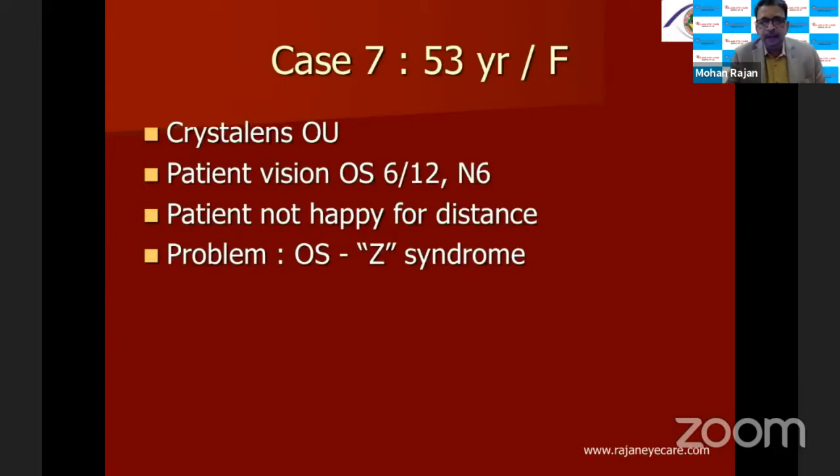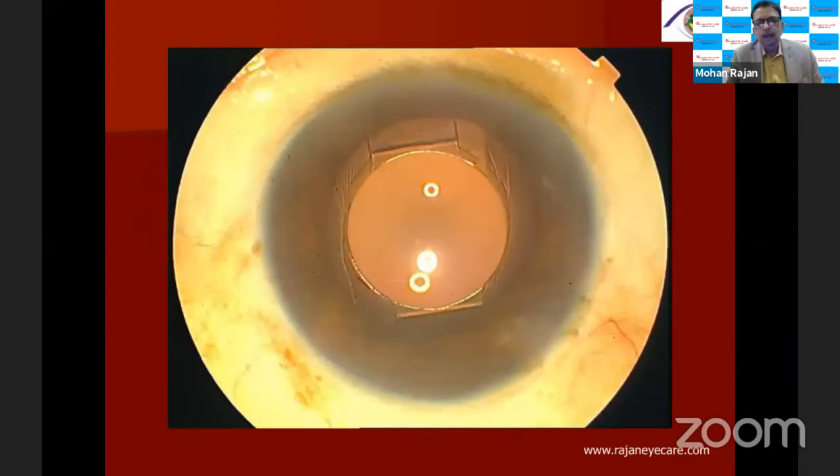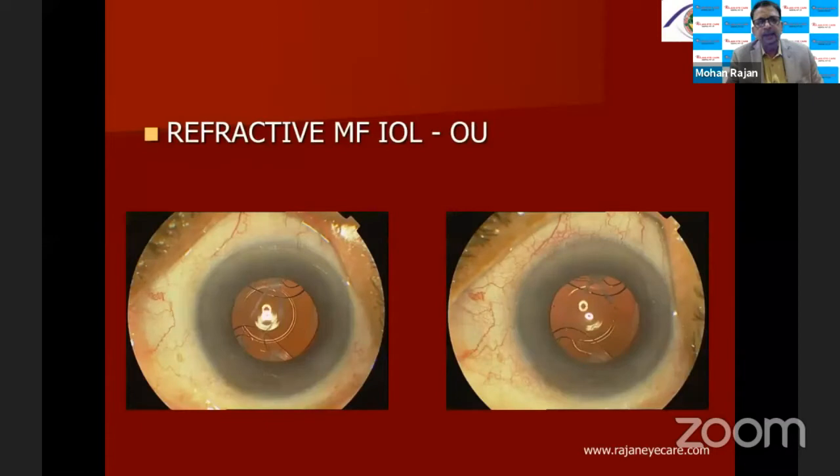Case seven, again, a Crystalens, used a lot of Crystalens. Patient not happy for distance, because suddenly what happens is the Crystalens can move forward and torque, that is twist, that is called the Z syndrome. And this is what happened. There can be a myopic shift. And this patient, I had to explant the lens as well.